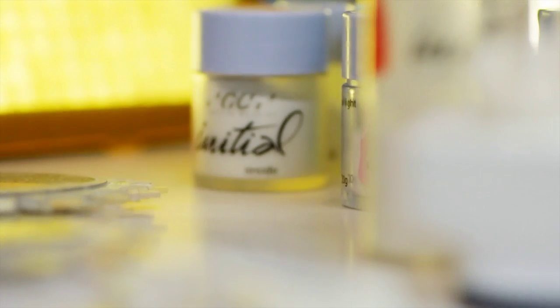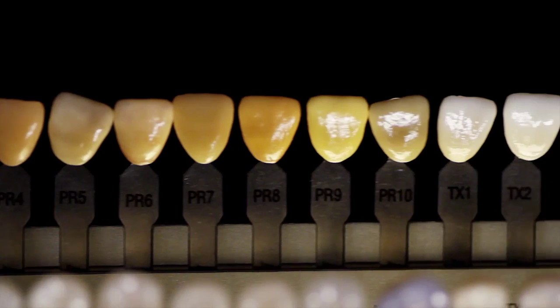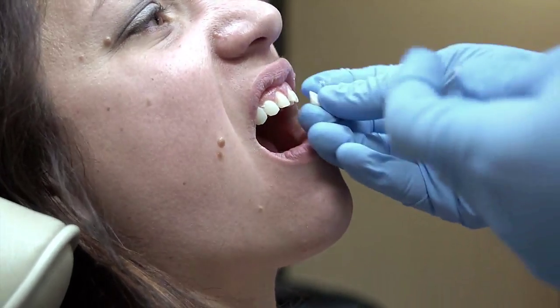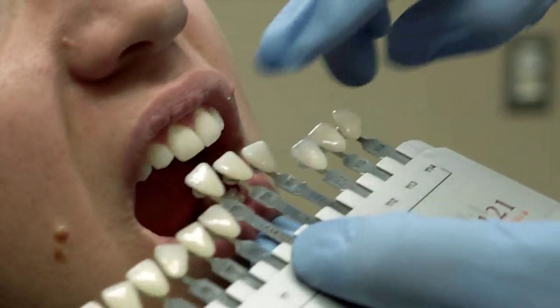This shade system is created in the same porcelain ceramic finish that your final product is. By using porcelain shade guide tabs, you know exactly what you'll receive from the lab because the materials are a match. There will be no more guessing what your final shade, including all modifications, will really look like when it is finished. In addition, for the safety of your patient and your practice, because these guides are porcelain, they can be sterilized after each use.